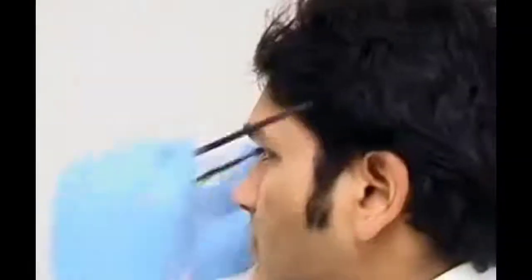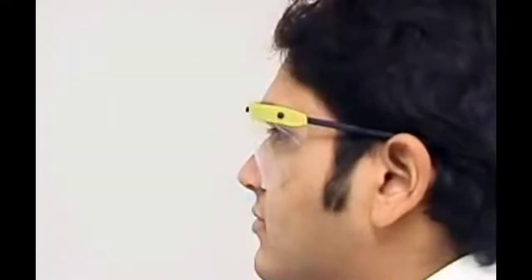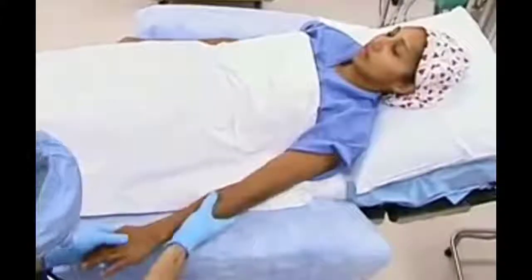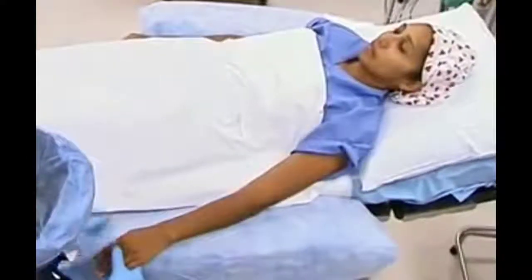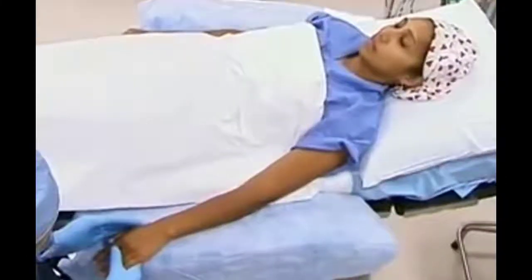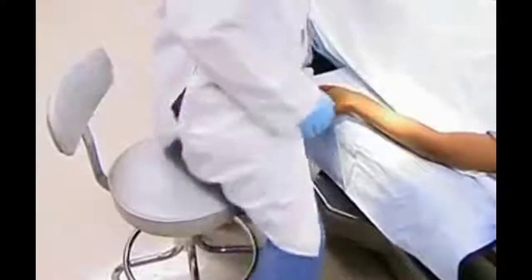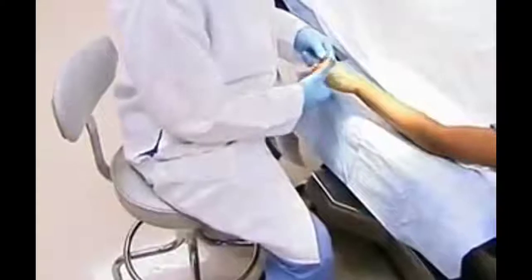You must follow standard precautions when placing a peripheral venous catheter. This includes washing hands, wearing gloves, and using eye protection because of the risk of blood splatter. When the selected site is in an upper extremity, the patient should be placed in the supine position with the arm supported. A comfortable position for the practitioner and proper lighting are important for successful intravenous cannulation.